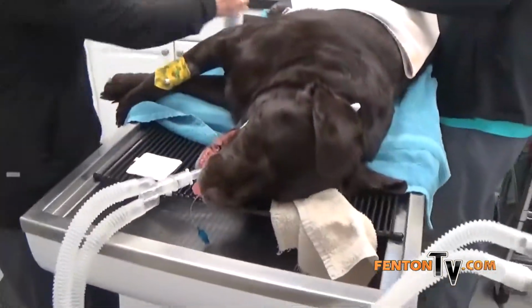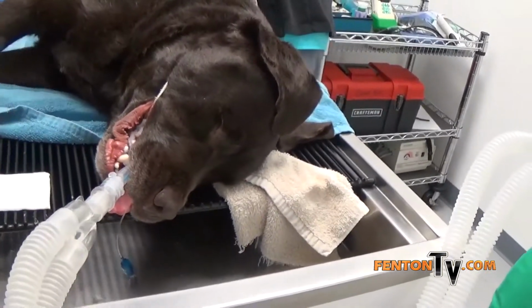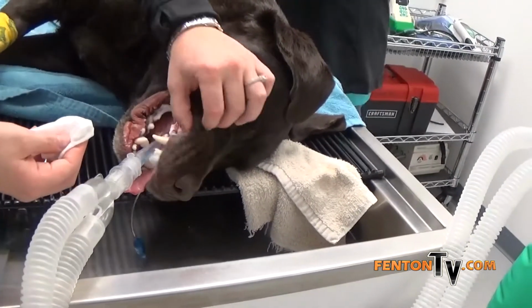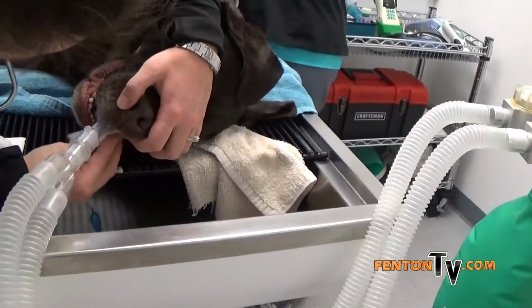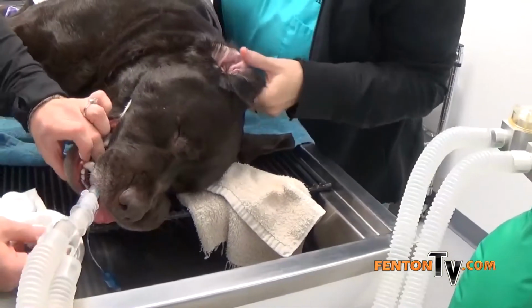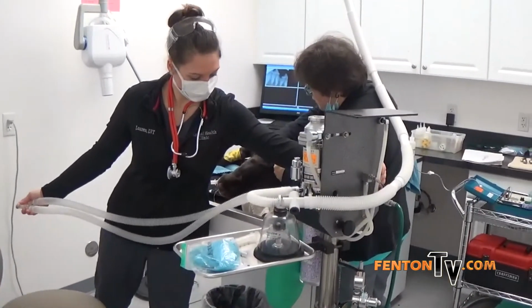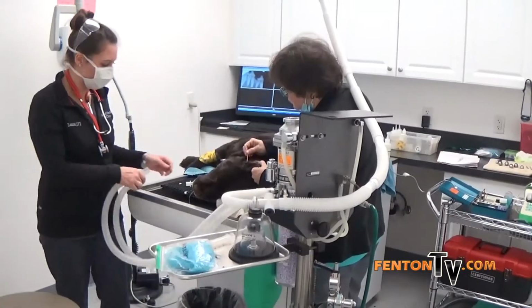And this is the fluoride treatment. Give him a spit and polish, but he has to bring his own spit. And I flush all the anesthesia out. So now he's just on O2.